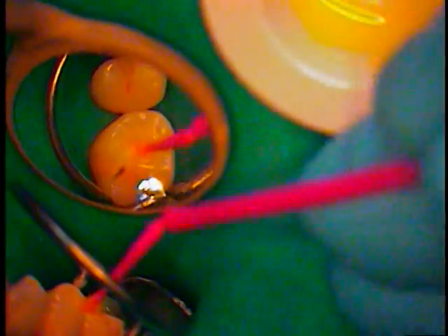Okay, we're back. I'm going to go ahead and apply bonding agents, and I'm doing this liberally, usually about 20 seconds to let it soak in. We'll get these guys done up in here.